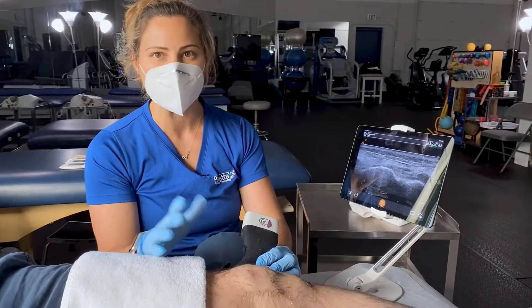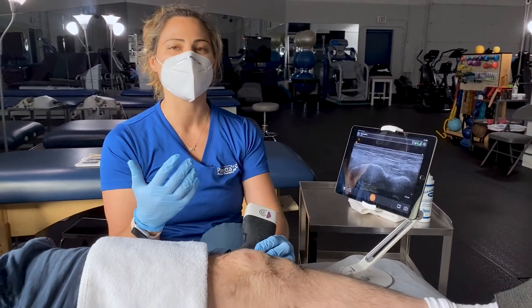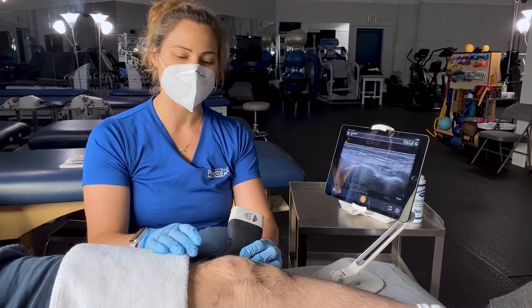If you're having any knee pain at all and you've been wondering what the cause of it might be, this is a great way to see inside.